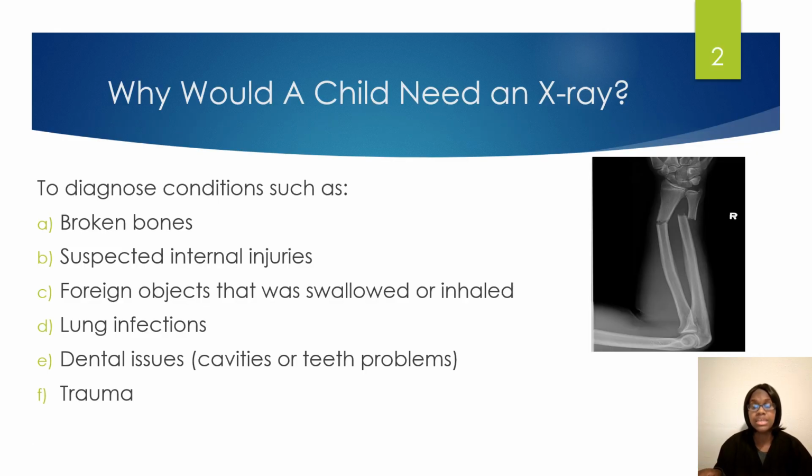Why would a child need an X-ray? As an X-ray tech, or if you work in CT or MRI or any other radiology modality, if a child needs an X-ray, the main reasons would be to diagnose conditions such as broken bones, suspected internal injuries, if a patient swallows or inhales foreign objects, for lung infections, dental issues such as cavities or maybe a chipped tooth, and trauma related reasons.